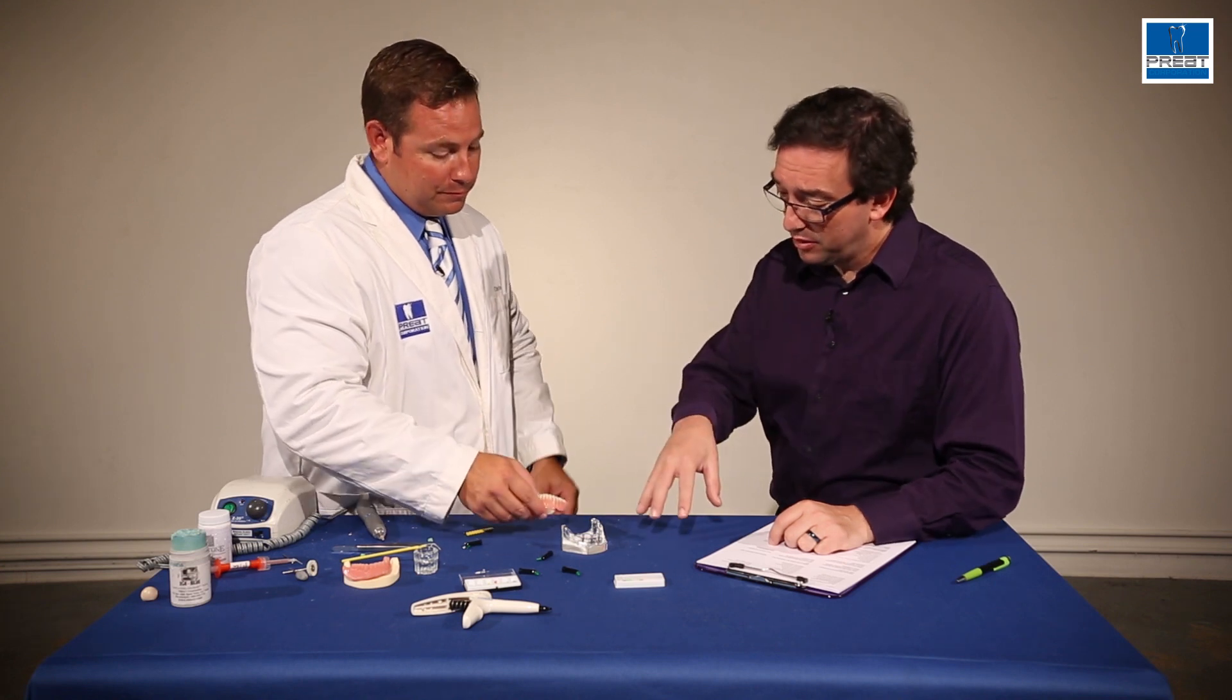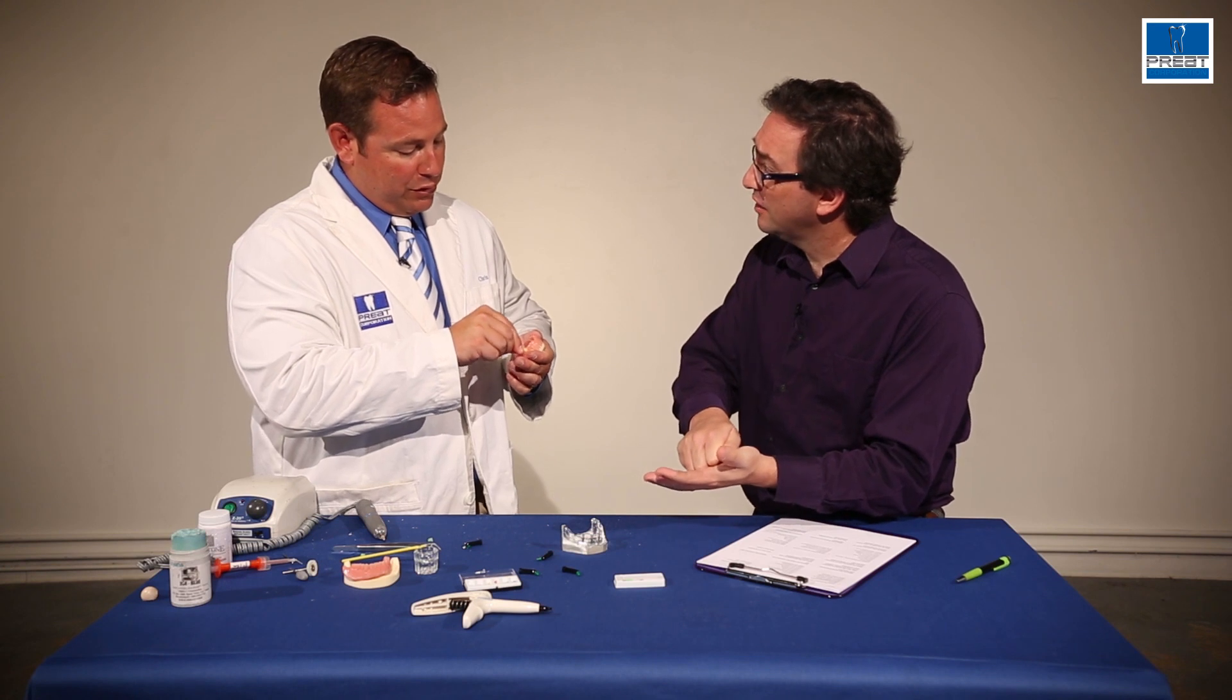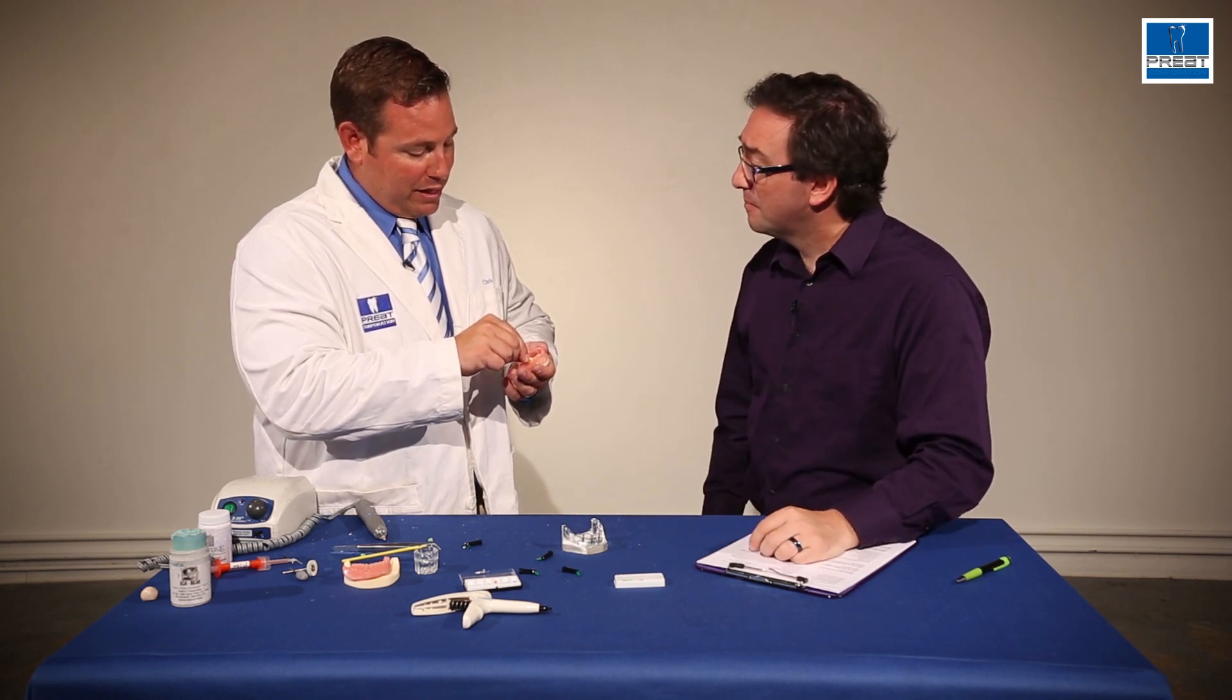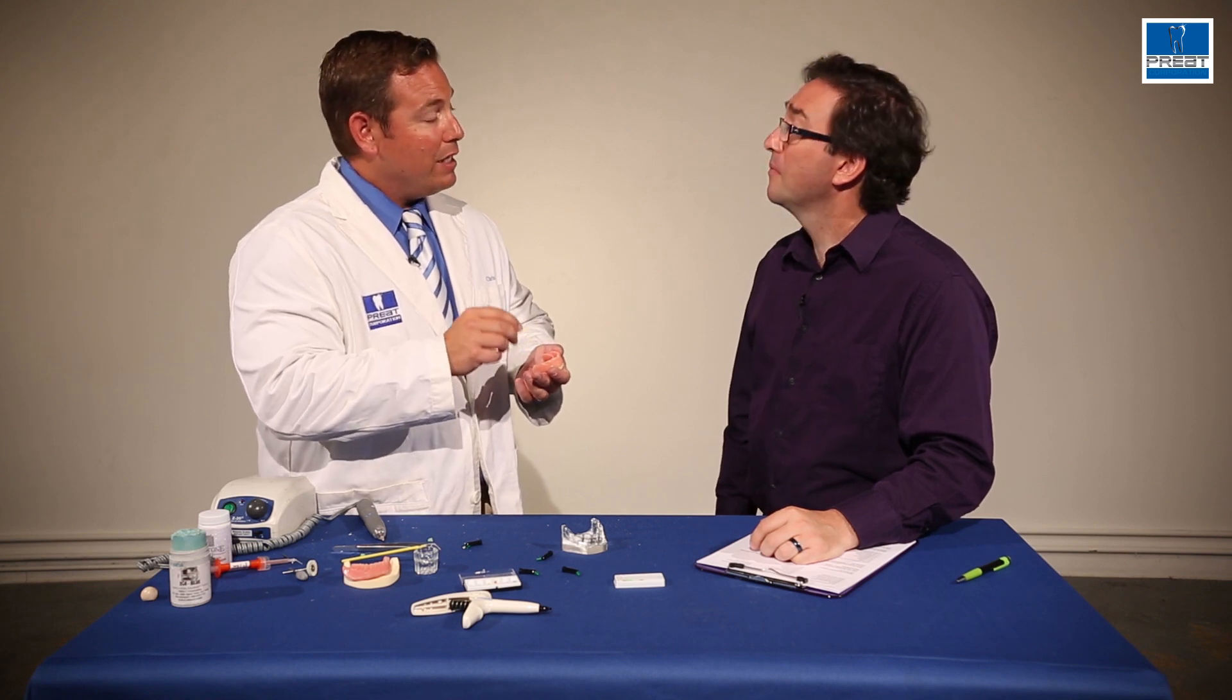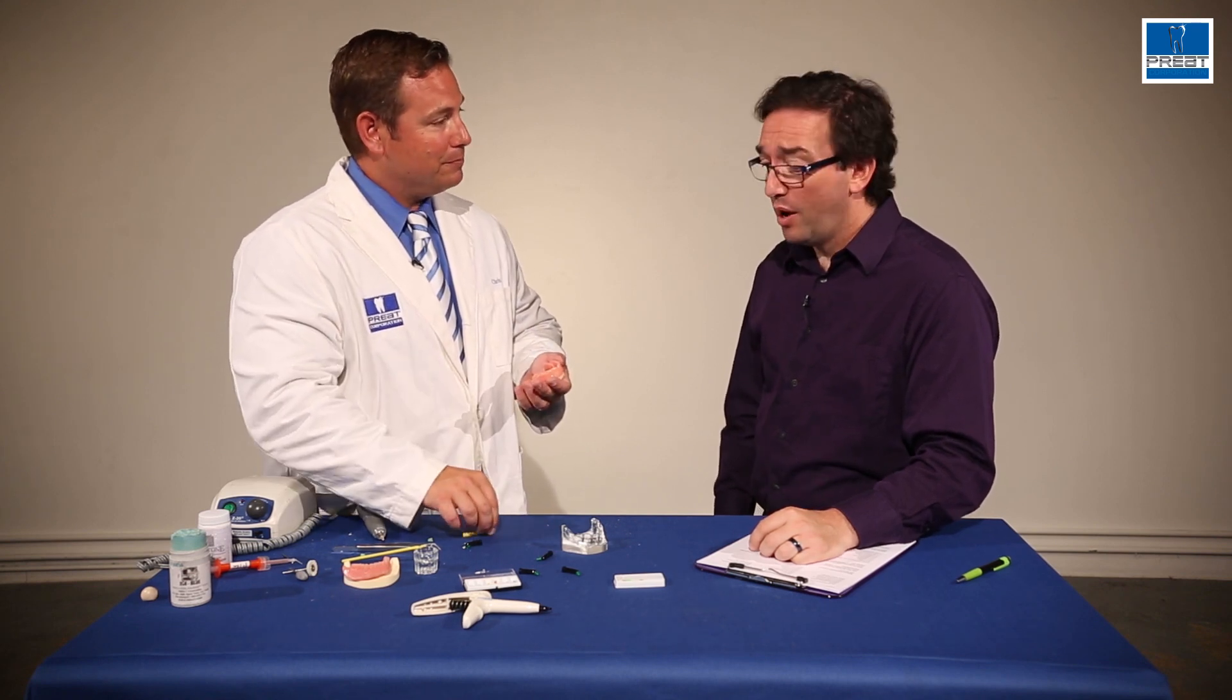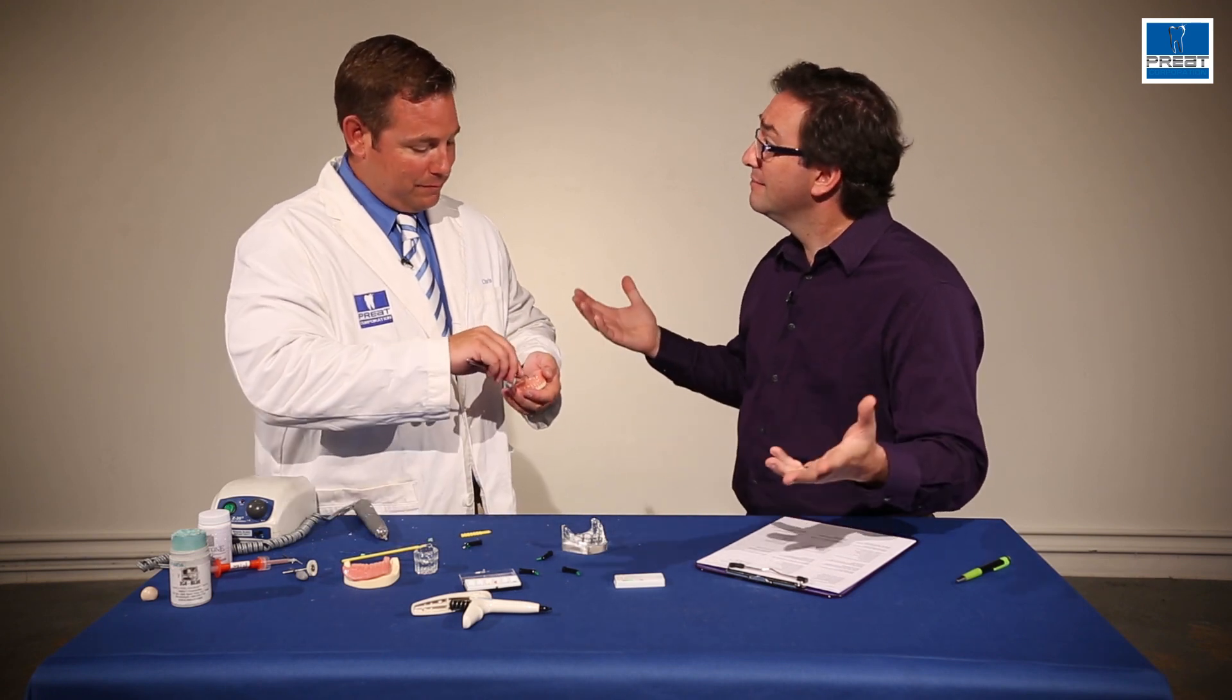So when you're pushing it into the mouth like that, does it feel like it kind of clips in? Absolutely. When it snaps onto the bar correctly, is it kind of a good clunk? You're going to hear that nice audible snap when the clip goes into the housing and also when the clip goes on the bar. All right. And it's as simple as that. Once you're done, it's in, stays in, life is good.